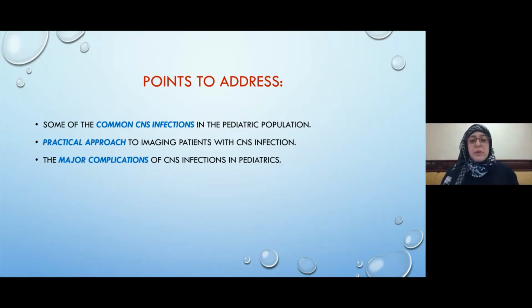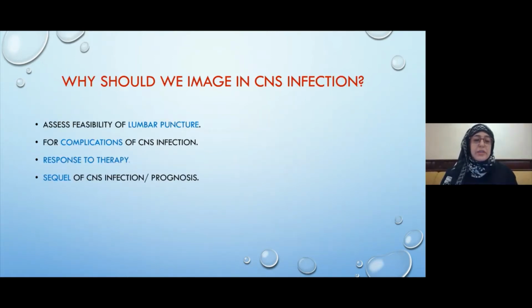And the main points that I would like to talk about are the common CNS infections in pediatrics, as well as the major complications. Complications of CNS infections may be the main reason for imaging these children, as well as checking the response to therapy and sequelae of the infection.